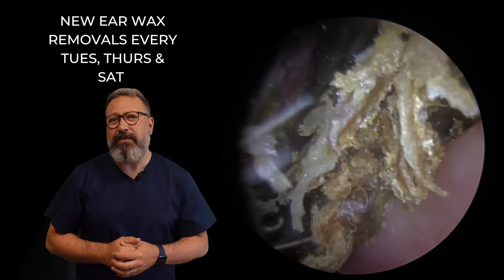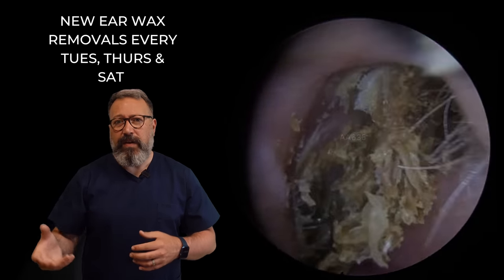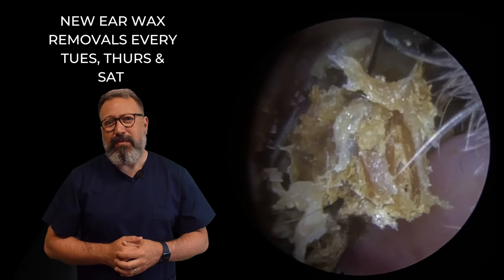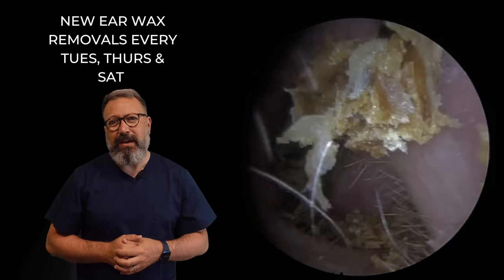Normally these patients would be coming through usually every six to twelve months to get this cleaned out. With COVID, a lot of the NHS appointments got cancelled, and it was difficult to get people in. This is one of those cases, unfortunately. But we've got a good chunk of that dry skin and wax material coming away.